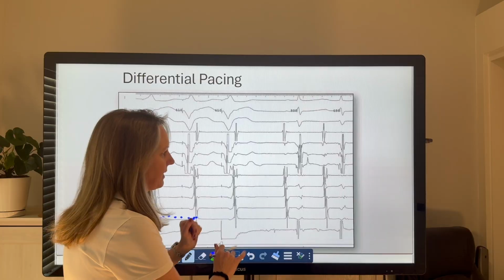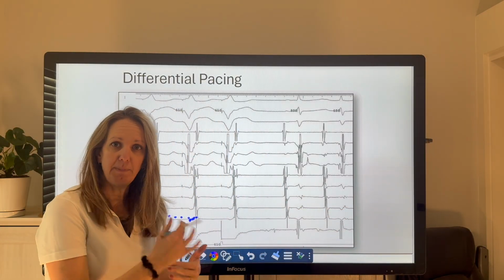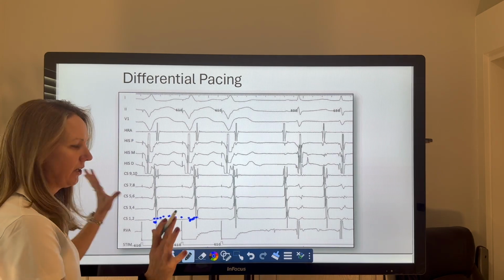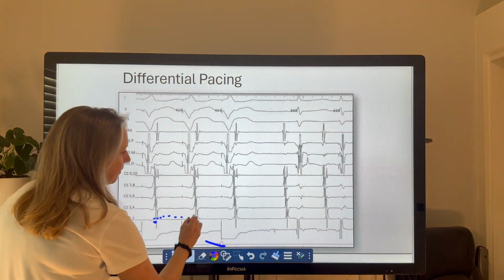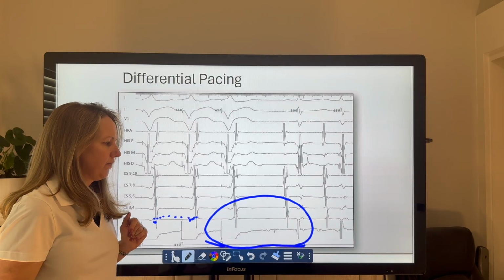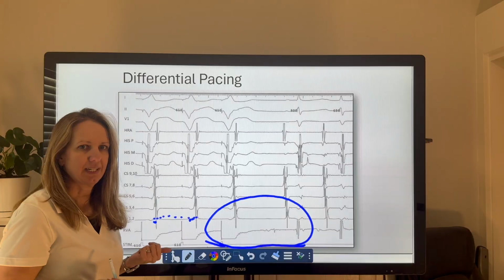When we stop pacing, tachycardia has to continue. If we meet those criteria, then we can interpret. Step one in interpreting, once we've determined we did indeed entrain, is to look at our response. What is our response here to this entrainment technique?